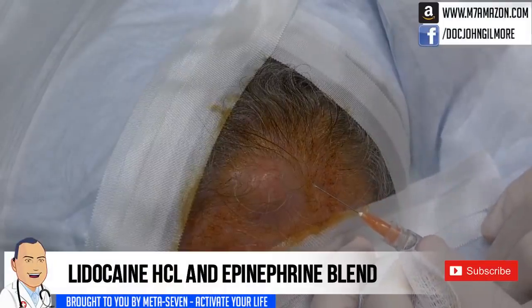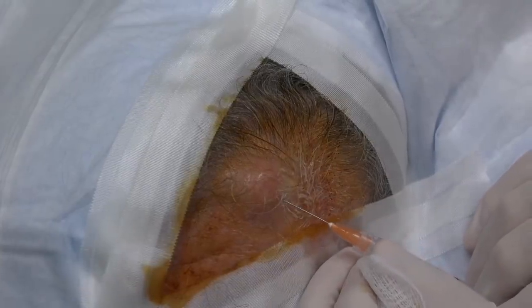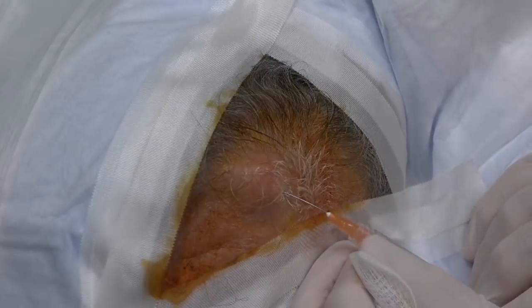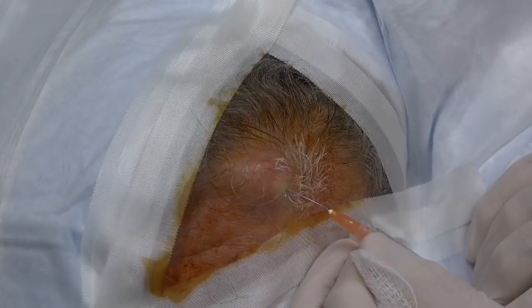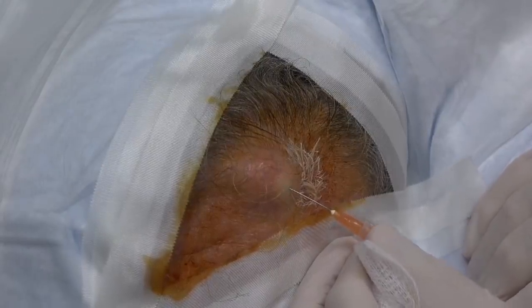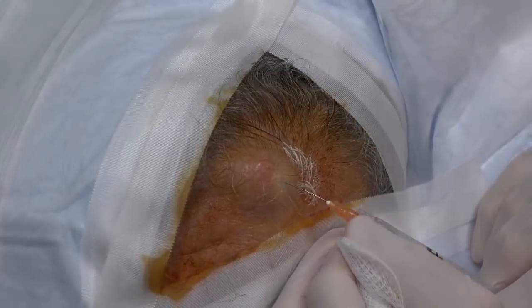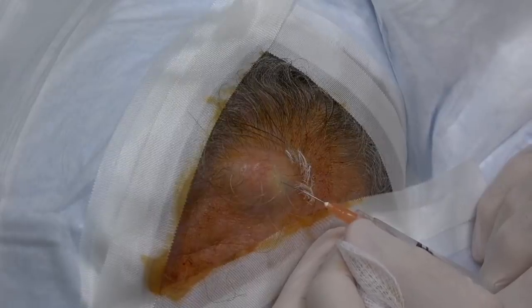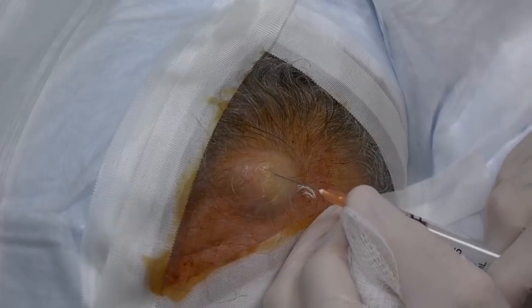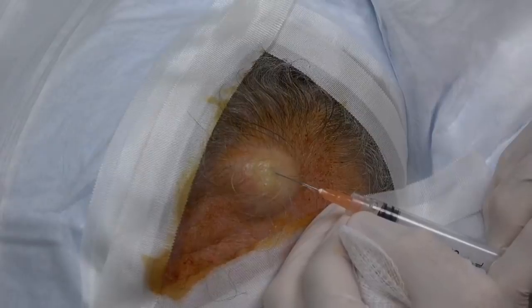I'm going to use a little bit of medicine here to numb you up. Are you ready? A little cold spray helps make it not hurt as much. You're going to feel a little stick, a sting and a burn. There we go, as the medicine goes in, working its way through, changing colors there. That means the skin is blanching from turgor pressure. The pressure from the medication is forcing everything else out of the interstitial area around the cells in the skin, so it changes color. This is just temporary. This does have a little epinephrine in it, so we should see less bleeding.